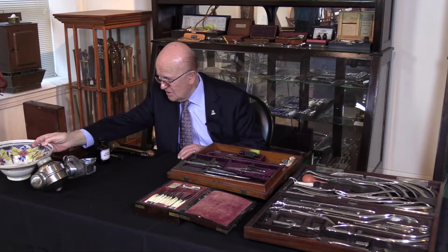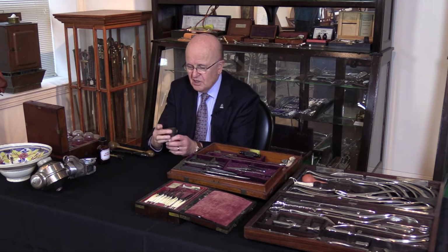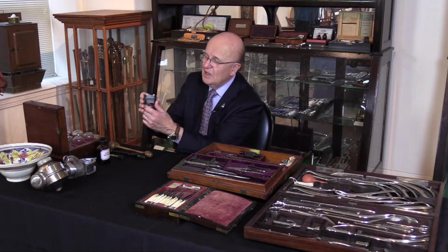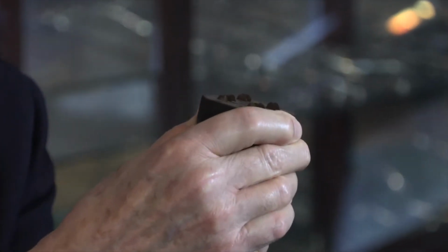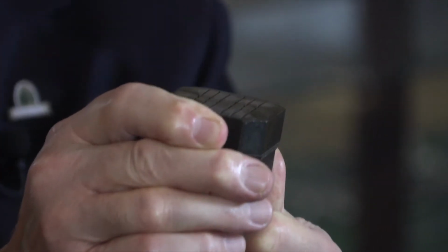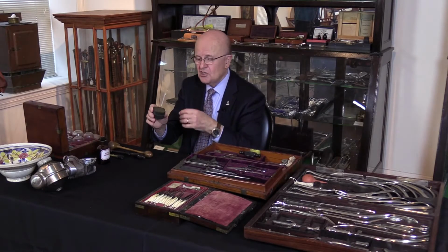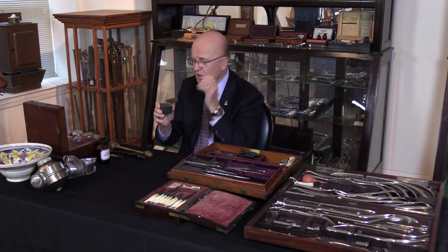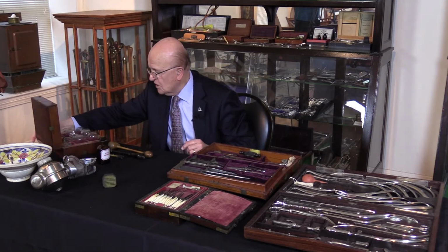The other one that did the same thing is making incisions using this little machine, which is a breakthrough from the earlier one. If you look closely, you can see that there are multiple blades here, 6 and 6, 12 blades, that you load like this, and then you let them go, and it will make small incisions, and the blood will start coming out. After they did that, they either collected the blood and threw it away, or used the cupping.